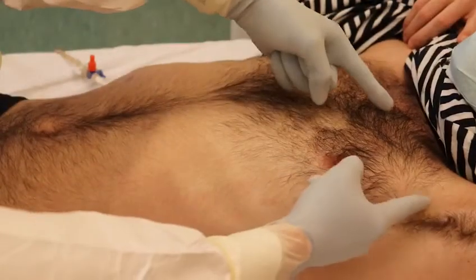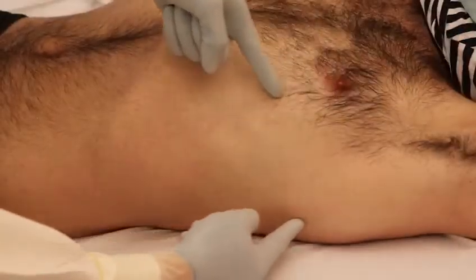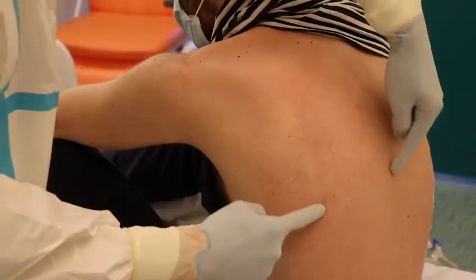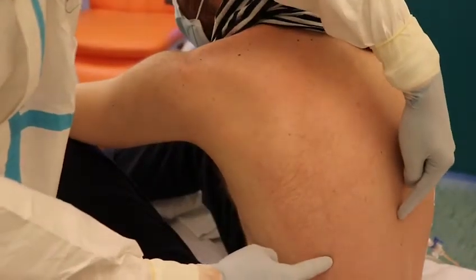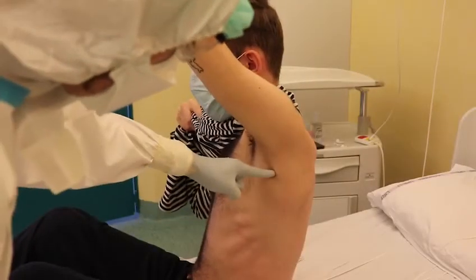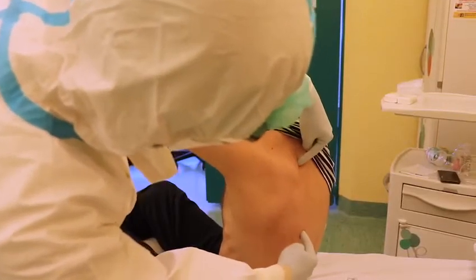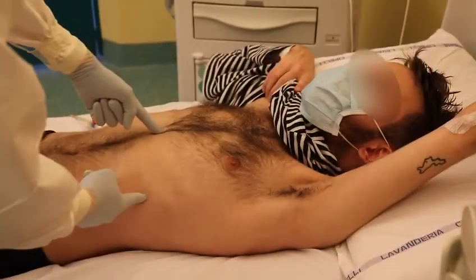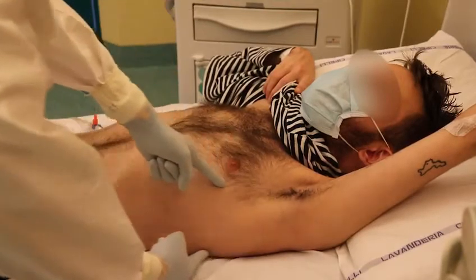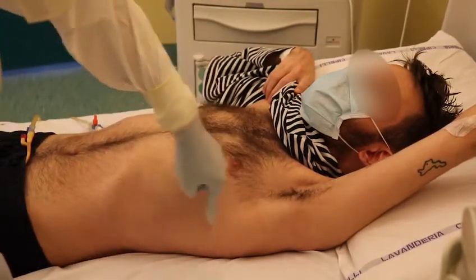Schematically, 6 different areas can be identified in each hemithorax, 2 on the anterior side, 2 on the lateral side, and 2 on the posterior side, by subdividing each side into 2 halves, upper and lower. All these 6 areas should be scanned if the patient is able to remain seated with the thorax in the upright position, whereas in those patients who can't stay up, the anterior and lateral side of the thorax, 4 areas overall, can always be assessed quite easily.